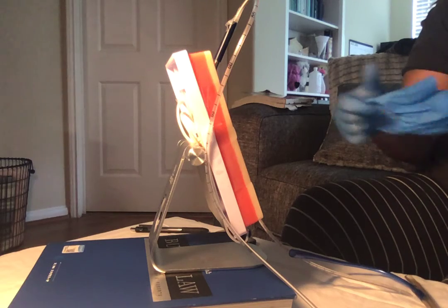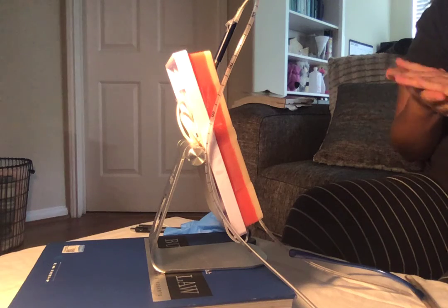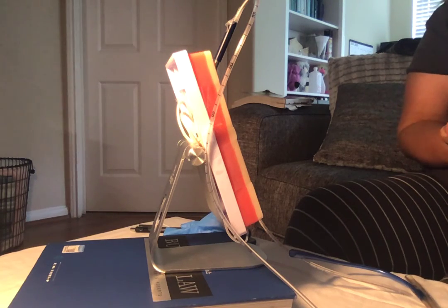I'm going to remove my gloves and perform hand hygiene. I'm going to place the call light by the bed and document the procedures and patient outcomes.